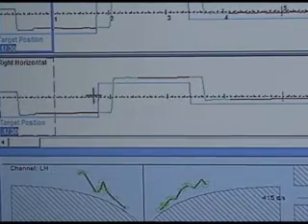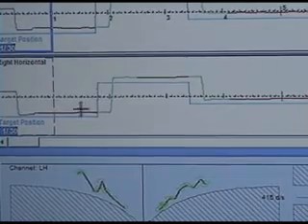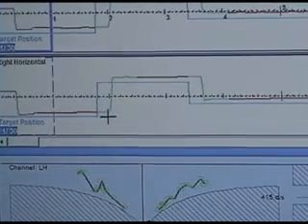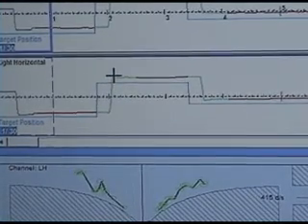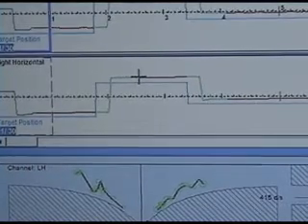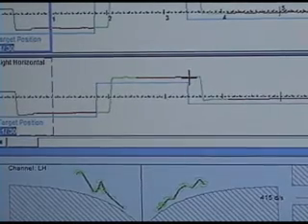That's the stimulus, that dot, and then this is the latency it takes for that patient to move their eyes there, and then do they land right on the target, which this person does, nice and square on the target. Then as they're staring at that dot on the right side, how stable are their eyes after that eye movement.